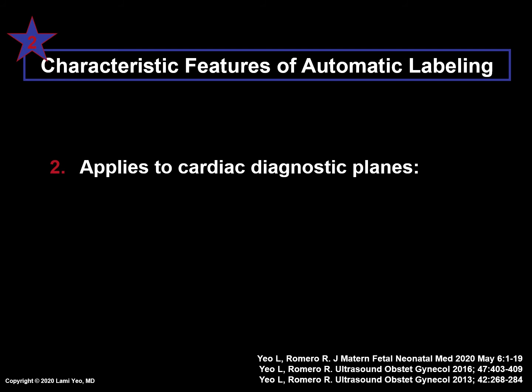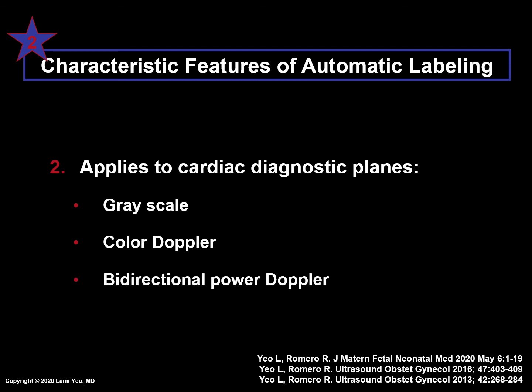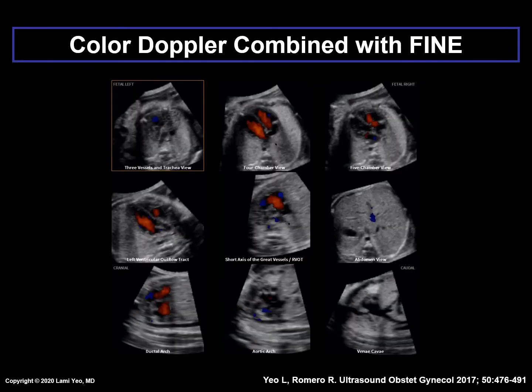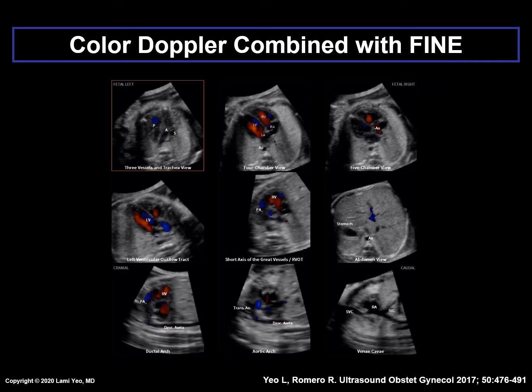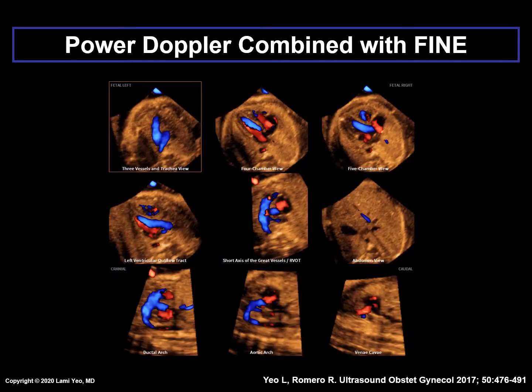Labeling can be applied to cardiac diagnostic planes that are in grayscale, color Doppler, or bidirectional power Doppler. This video clip shows color Doppler combined with FINE technology applied to a normal fetal heart. The diagnostic planes are shown first without and then with automatic labeling activated through intelligent navigation. This video clip shows bidirectional power Doppler, also known as S-flow, combined with FINE technology applied to a normal fetal heart.